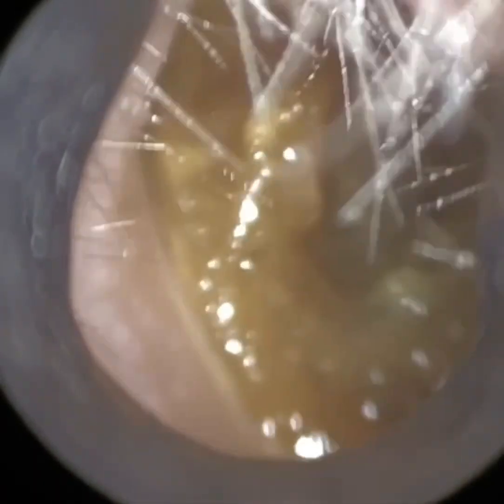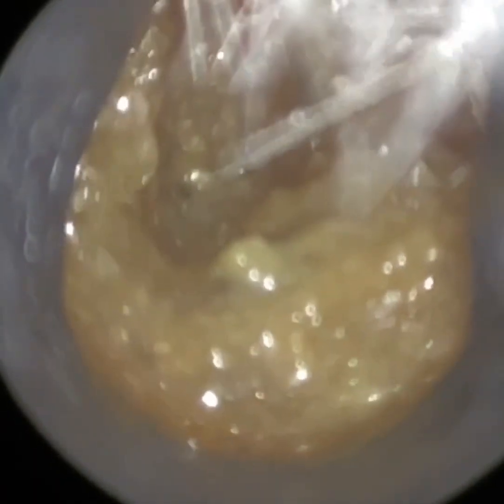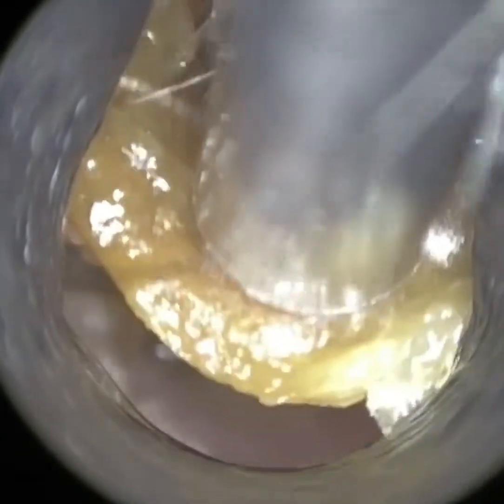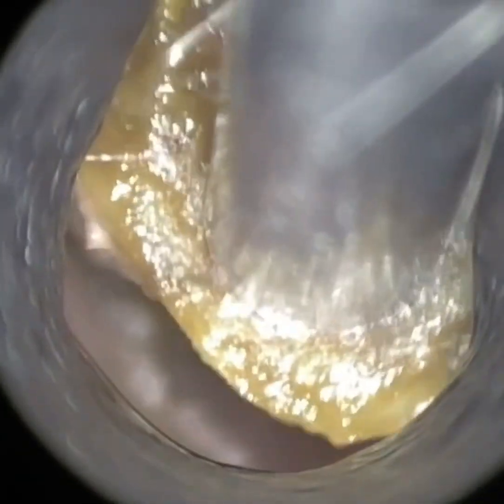Hello, this is Mr. Neil Reiteter, consultant audiologist and director of Clearwax. Thank you for joining me in a very quick, short video demonstration of our newly developed wax coat, which is due to be launched early autumn 2022.